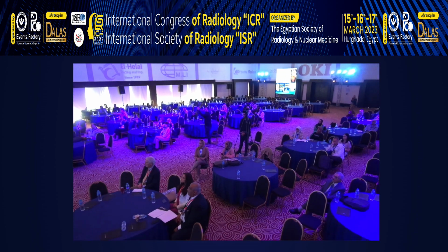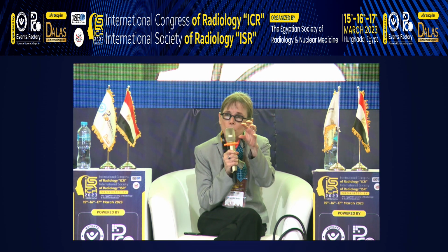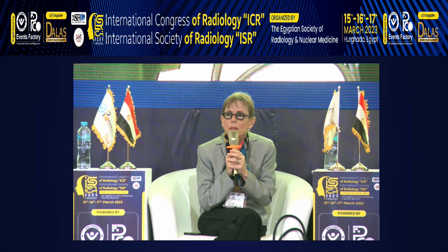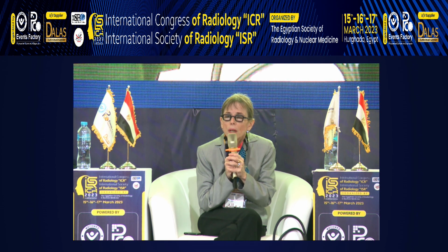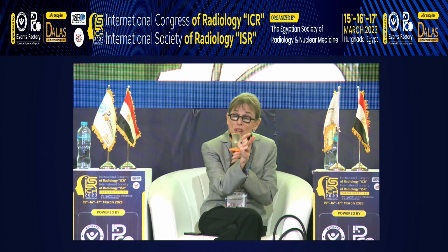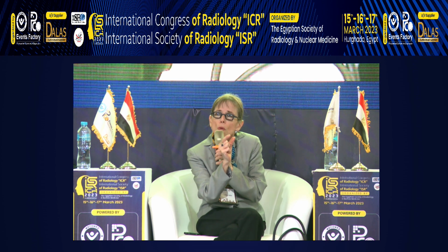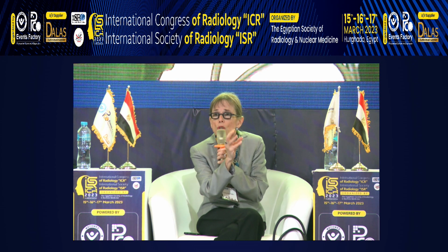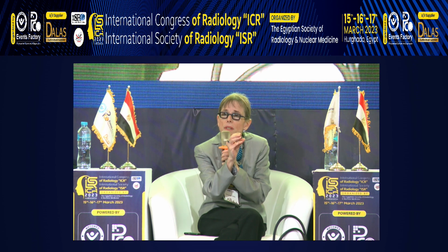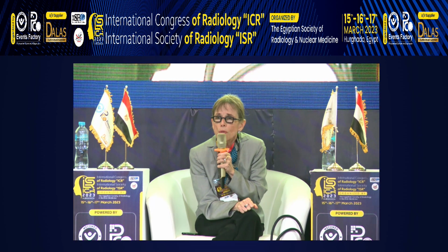I'm not sure I understood the question. The case of sinus thrombosis you are referring to, you're asking about the low signal on the GRE? No, actually, I mean the sinus itself, it was bright on GRE. The sinus itself being bright on GRE? Yes. So this is because there was slow flow still in the sinus. So not necessarily the clot itself bright, but the slow flow in the sinus due to the partial thrombosis.